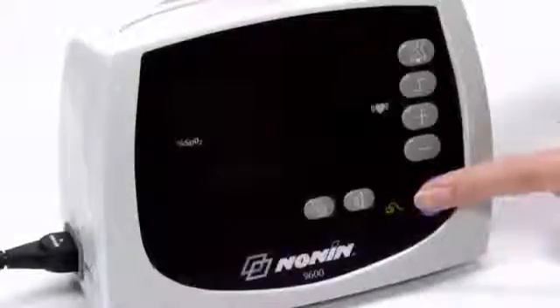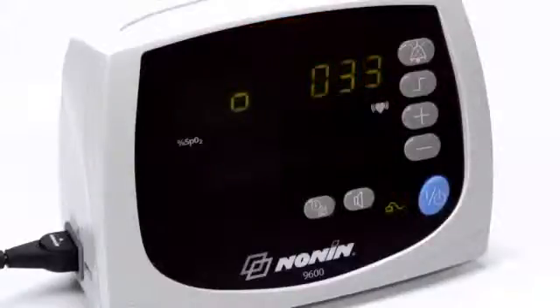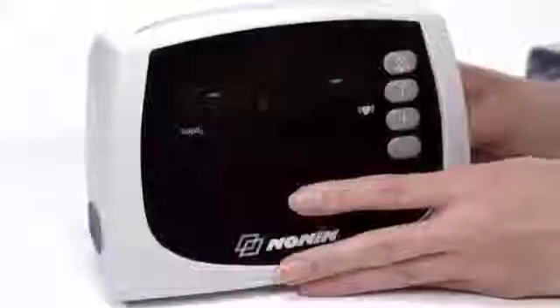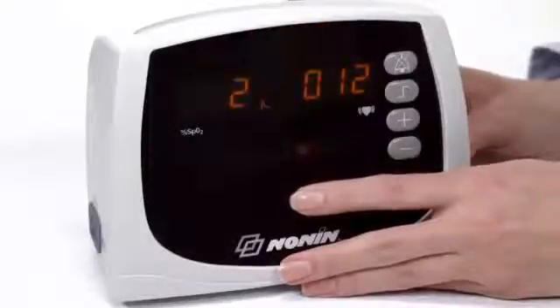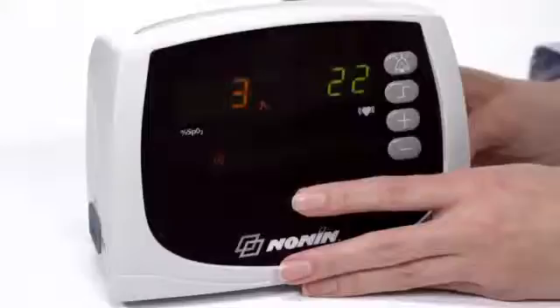Press the on-off button to start the unit. The oximeter will run through a start-up check as it turns on. Check the oximeter's time and date settings for accuracy. You can set the time and date by pressing the clock button and using the scroll buttons to set the proper time and date.